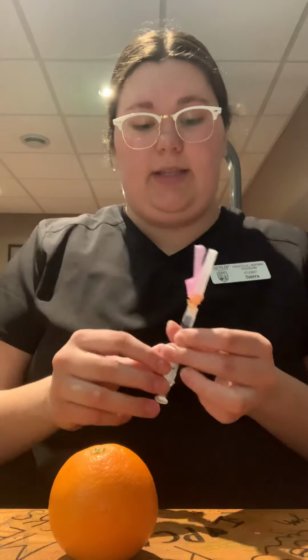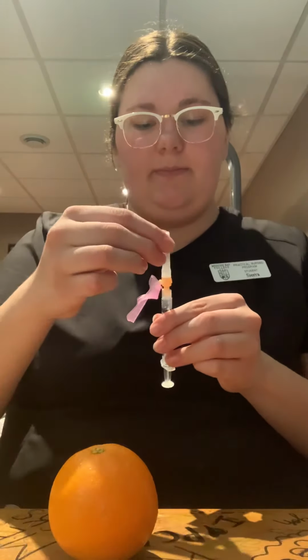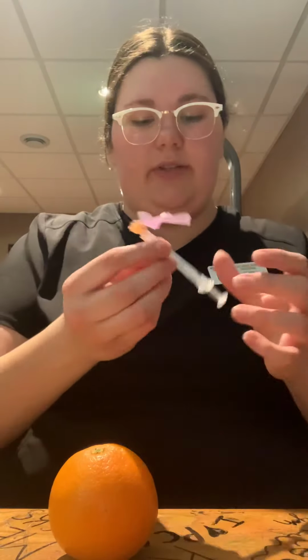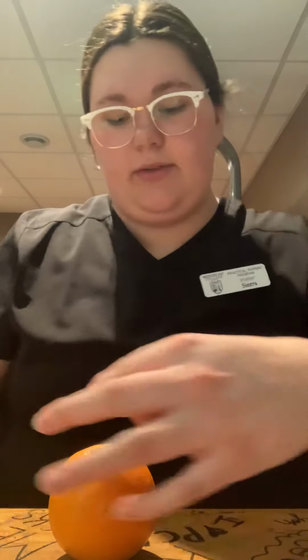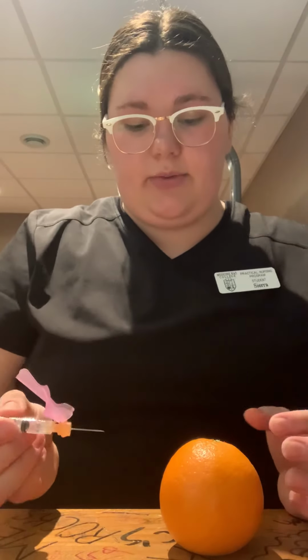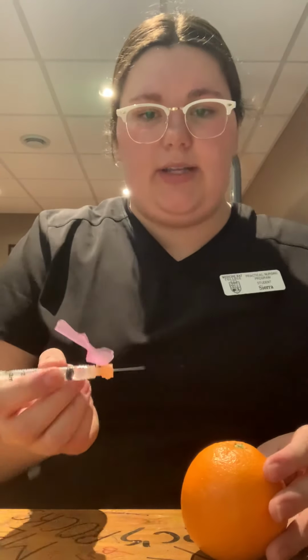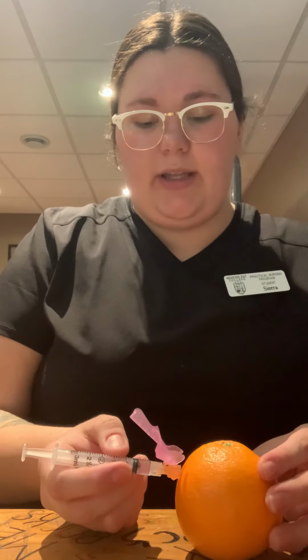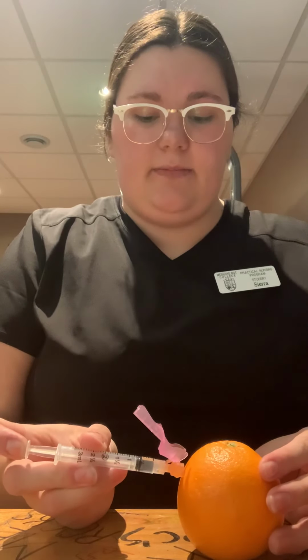So now that we're ready to give our injection, we're going to pull the safety down, remove the cap from the needle, with our safety upwards. I need to use my dominant hand, sorry, so I'll turn the patient. We're gonna go 90 degrees into the orange because this is an intramuscular injection, so we wanna go straight into the muscle. So I will do that. Straight in. At a slow and steady pace, we're going to inject the medication.